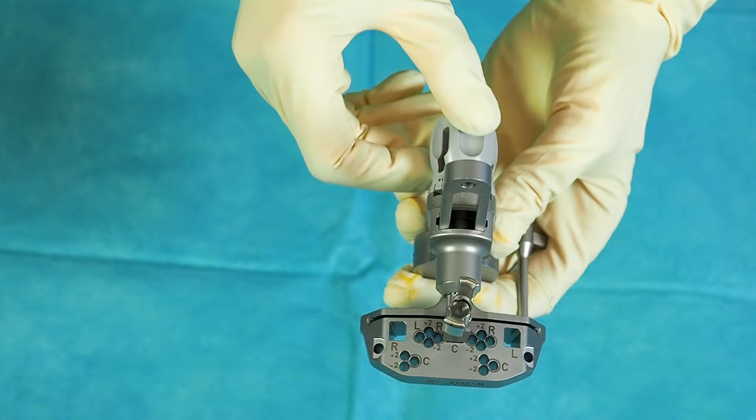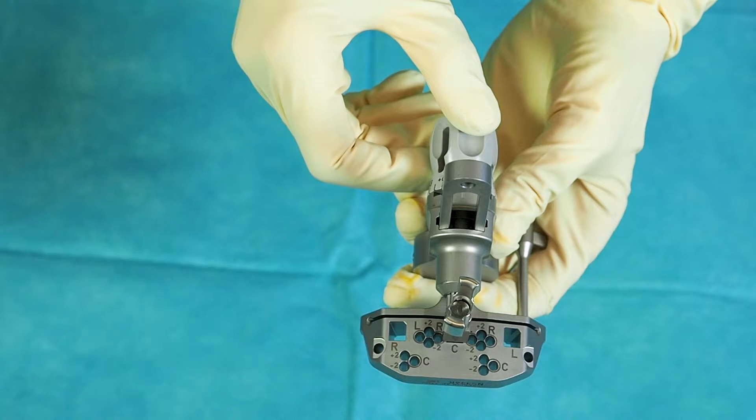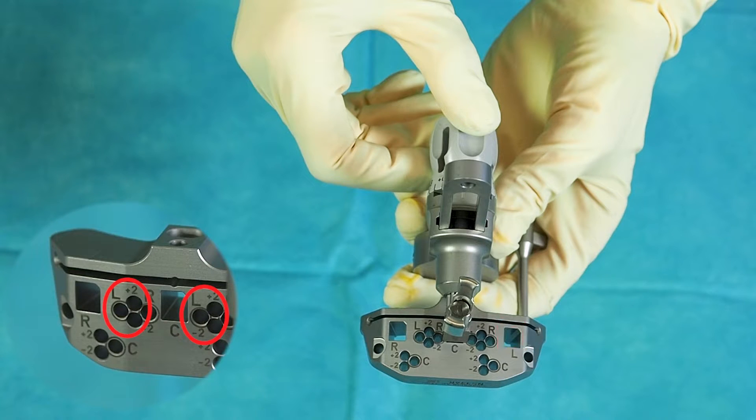In case of a less invasive approach for the right knee, engage the holding rod in the hole marked with R. For fixation, use the highlighted pinholes. In case of a less invasive approach for the left knee, engage the holding rod in the hole marked with L. For fixation, use the highlighted pinholes.